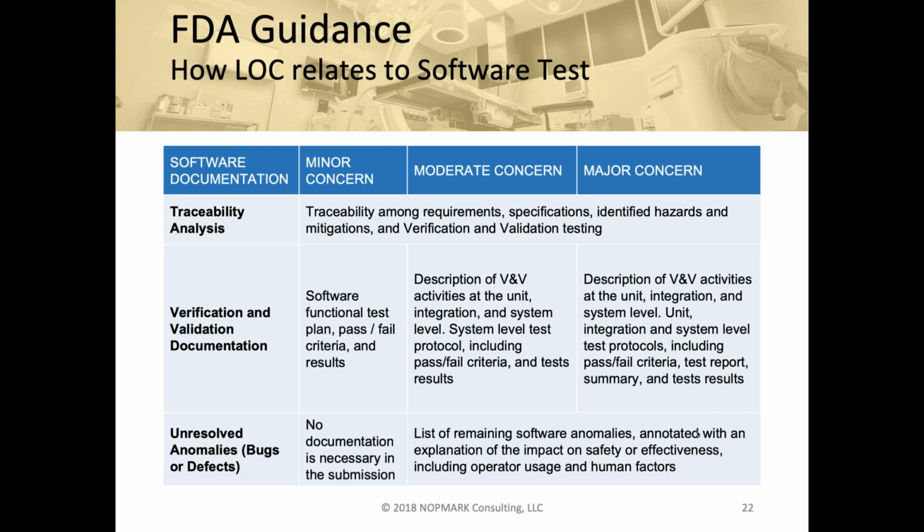Most medical device software that you'll see lives in that middle box, that moderate level of concern, where we have formal system-level protocols. Commonly they're referred to as procedures. Some in the industry call these plans, but here we're talking about procedures. These are all our test cases grouped together by features. This is where our test steps and expected results live. That's what's called a protocol here.